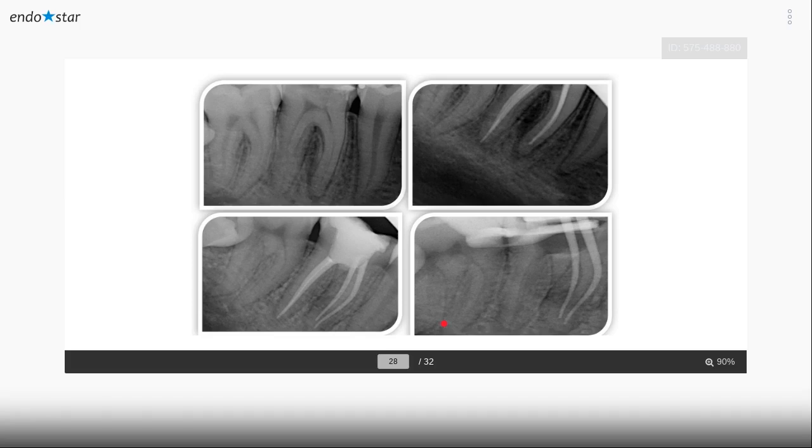Given the anesthesia, nerve block normal, remove the caries, gain the access. And when I started with file 25 taper 6 Azure, no orifice opener, no manual files. The canal wasn't that wide, especially the mesial canals.